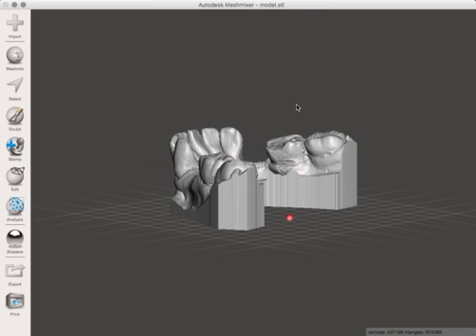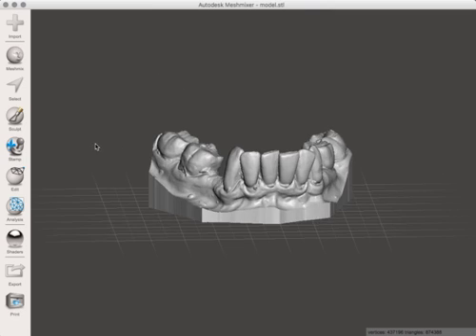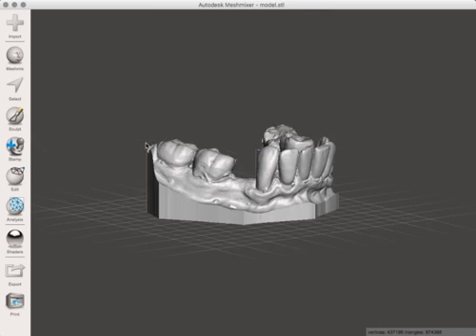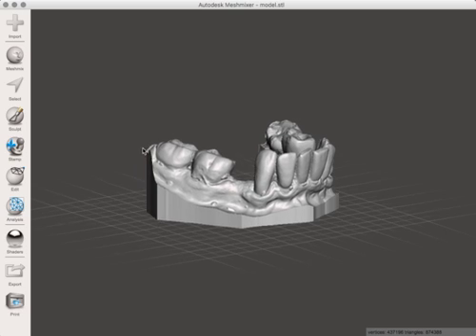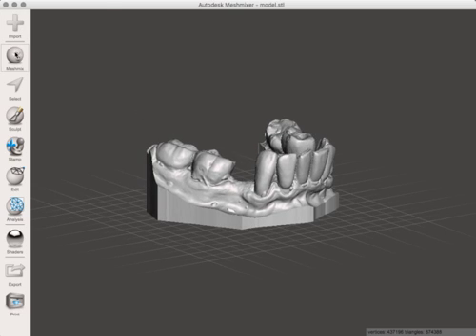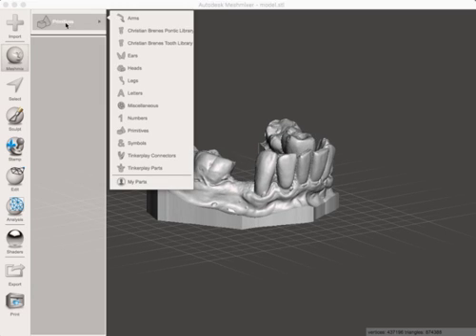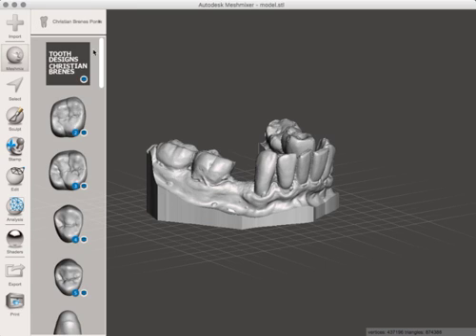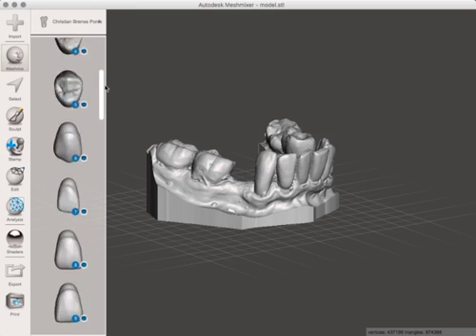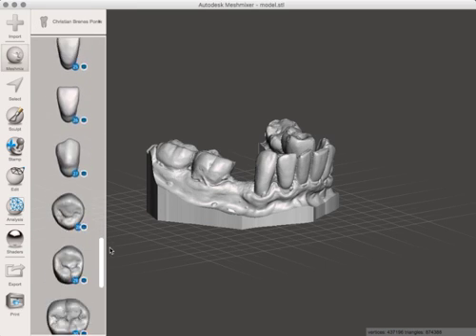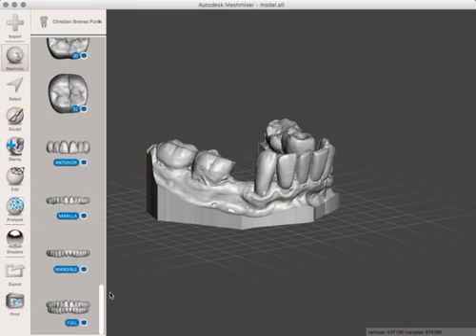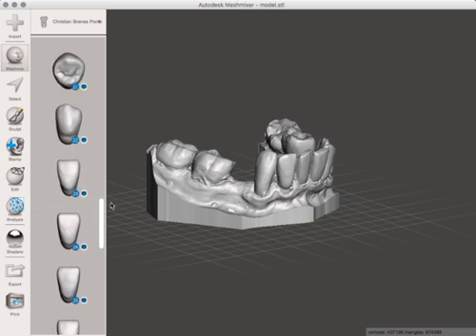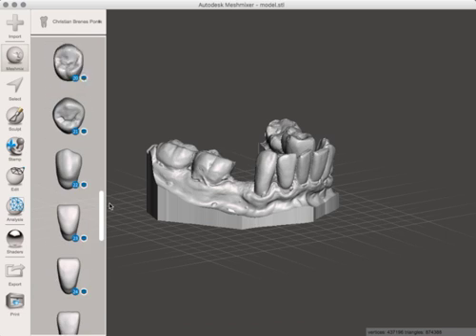So once the model's in there, you can kind of see this patient's missing a couple teeth. We can now come into here, and here's both of those libraries. These are the Pontics, okay, all the way down to a full set.